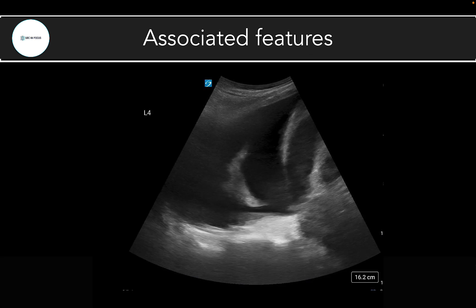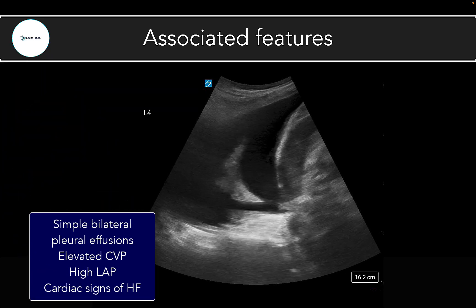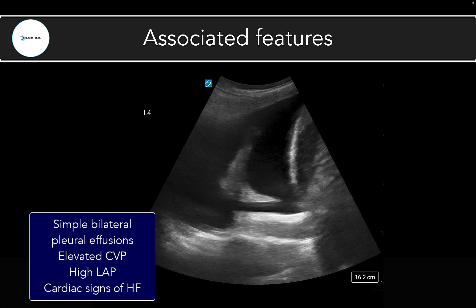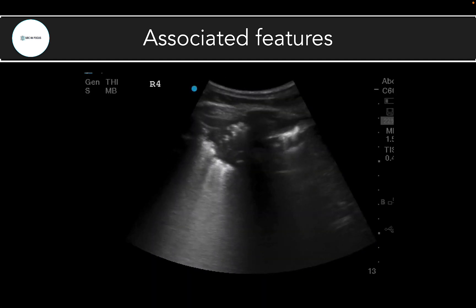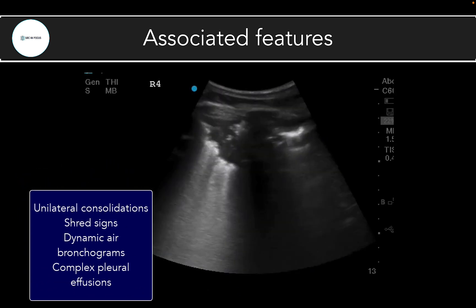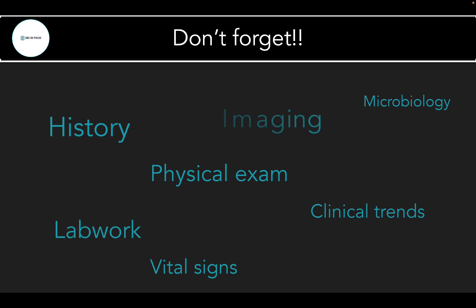Lastly, look at other associated ultrasound features. With cardiogenic pulmonary edema, these can include bilateral simple pleural effusions, markers of elevated CVP, elevated left atrial pressure, or cardiac scans supporting a CHF picture. With infectious or inflammatory pathologies, these might include signs of pneumonia like a shred sign, dynamic air bronchograms, complex pleural effusions, or other findings. Never forget the importance of integrating the rest of the clinical picture — POCUS is never meant to be a standalone test, so clinical history, vital signs, physical exam, lab findings, and other imaging parameters are all essential.